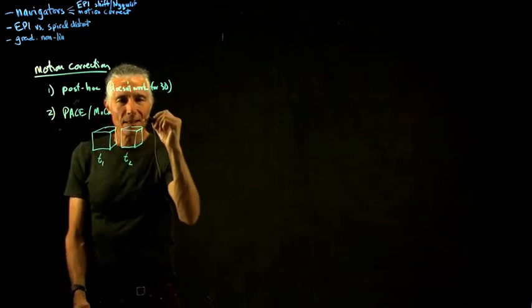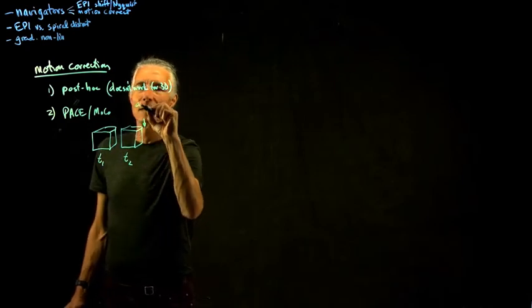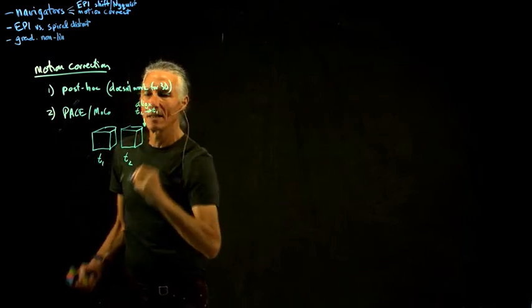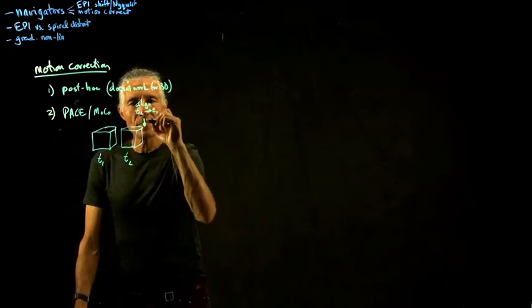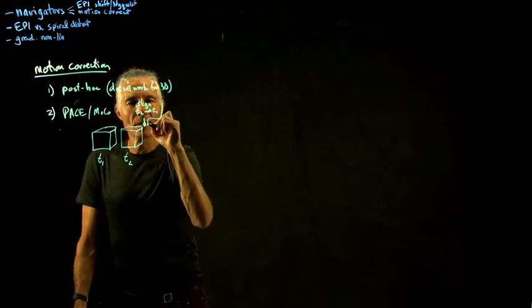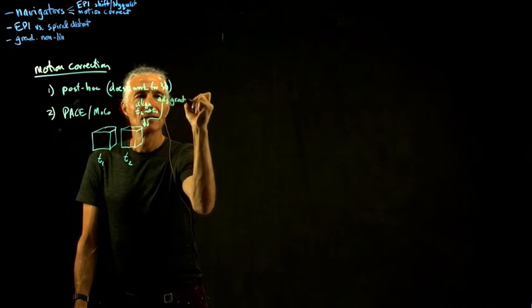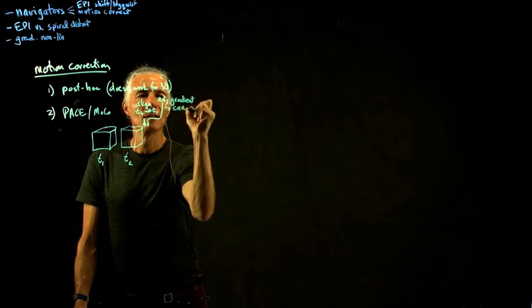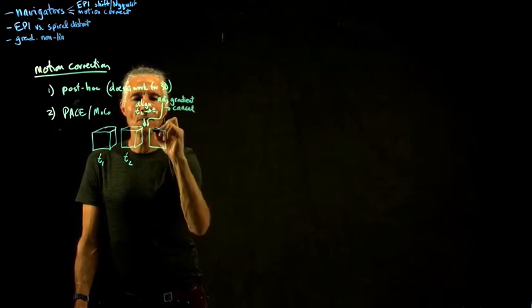And then at this point right here, align T2 to T1. And then very quickly, adjust gradients to cancel. And so then T3 will be correct.